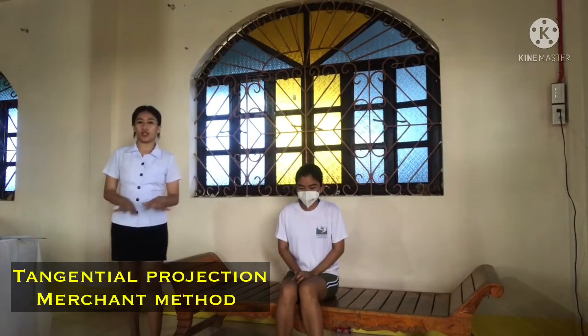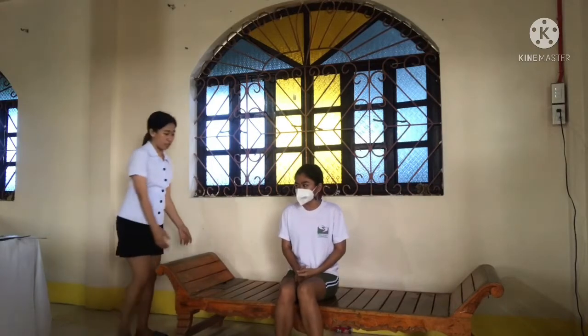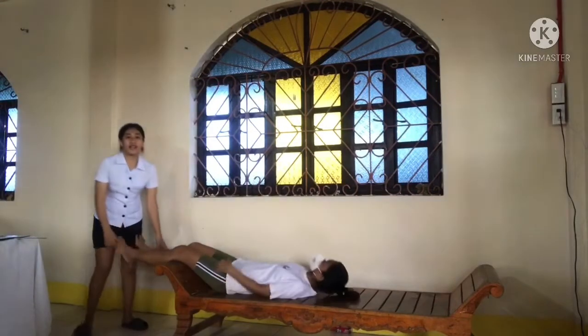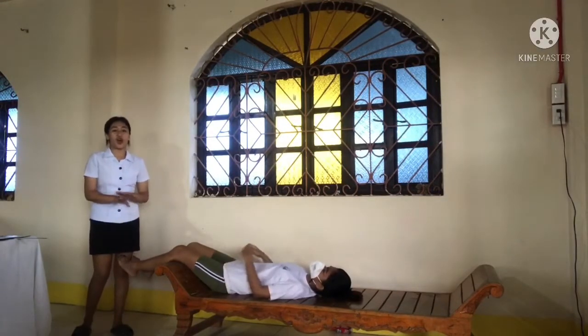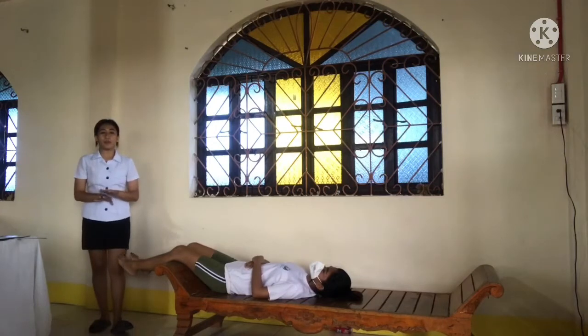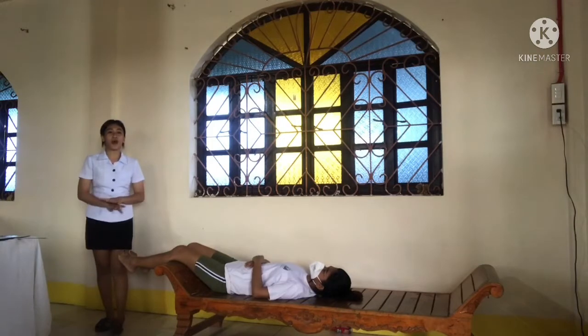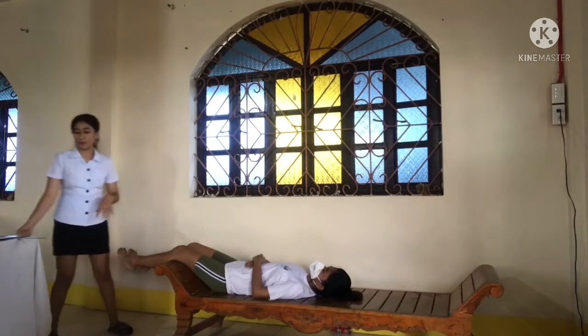So next, we have the tangential projection, Merchant method. So the IR used for this projection is 24 by 30 centimeter crosswise. So place the patient in supine position with both knees at the end of the radiographic table. Adjust the angle of the knee flexion to 40 degrees. Place the IR perpendicular to the central ray and resting on the patient's shins approximately distal to the patella.